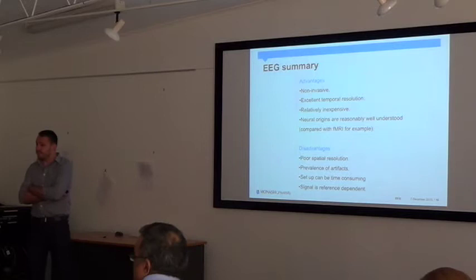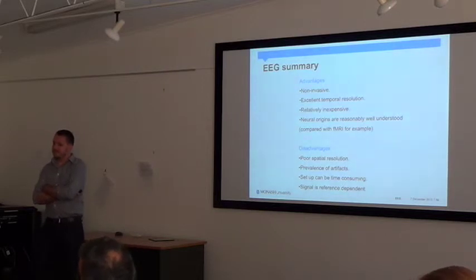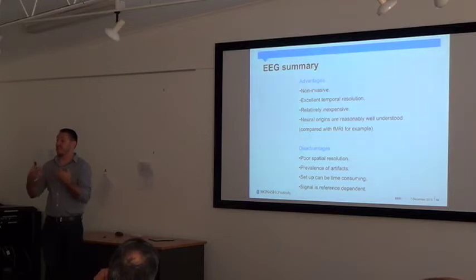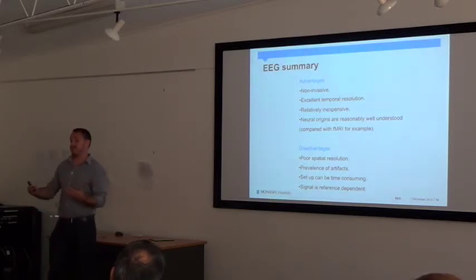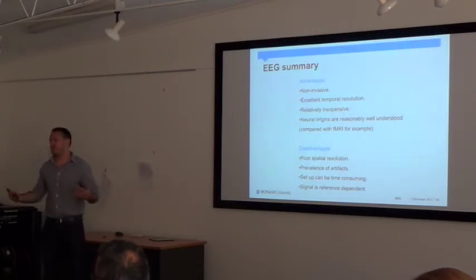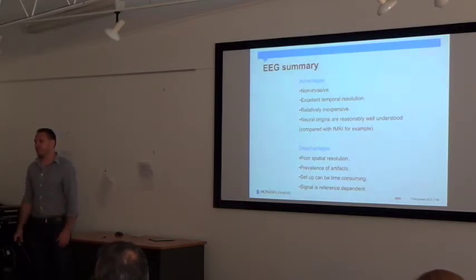Sure. Say you get a difference between two groups in terms of gamma power or something like that. What's the interpretation? So again, it comes down to this idea of groups of cells being able to synchronise activity. That's essentially what you're measuring, the synchronous activity of large groups of cells. I didn't go into it today, but there's a whole theory in terms of how this synchrony is important in neural communication, how it underlies things like neuroplasticity and all of these other brain functions. It may be the important thing in terms of the emergence of higher order brain functions. So it's this whole idea of the brain being able to communicate effectively, generally how it's interpreted loosely.